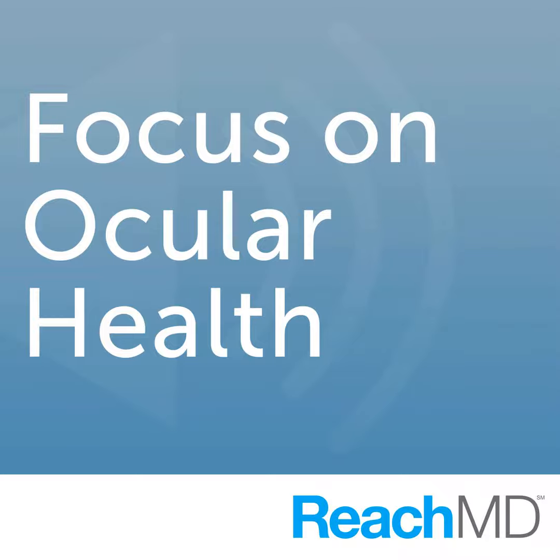Well, the next step for this particular device, the artificial retina, is to get it to a level where we can get patients and subjects to be able to recognize faces. And beyond that, can we actually get them to read large print? Through the Department of Energy program and also the National Science Foundation grants, we're pushing the envelope, because it's not easy to go from 60 electrodes to, let's say, 1,000. We have guessed through simulations and sighted volunteers that about 1,000 will get you face recognition and reading vision, and so that's what we're aiming at.